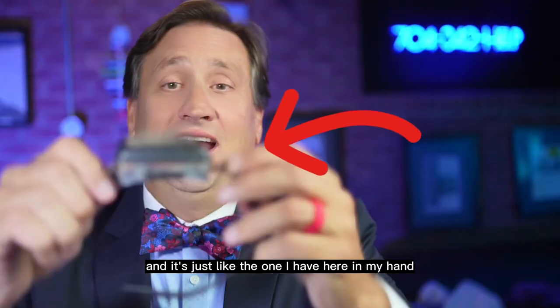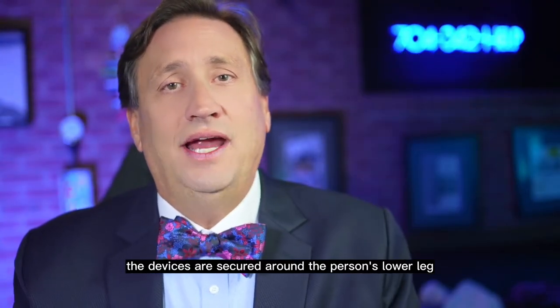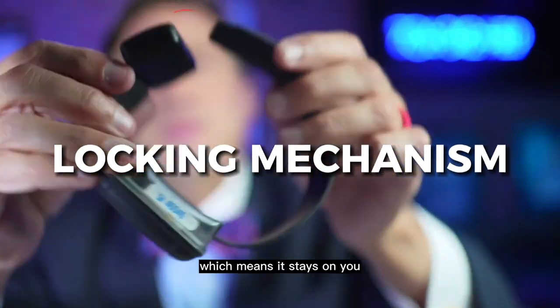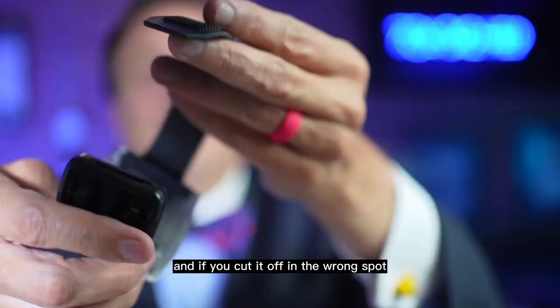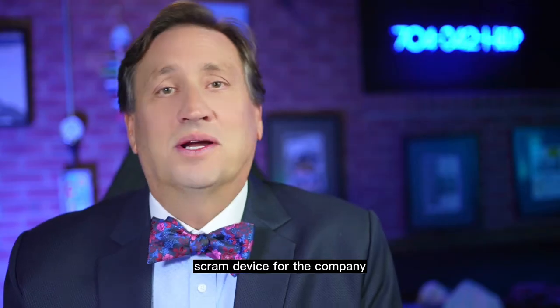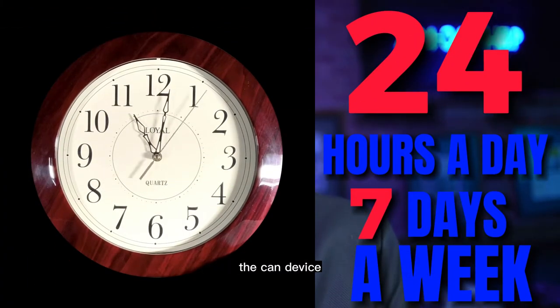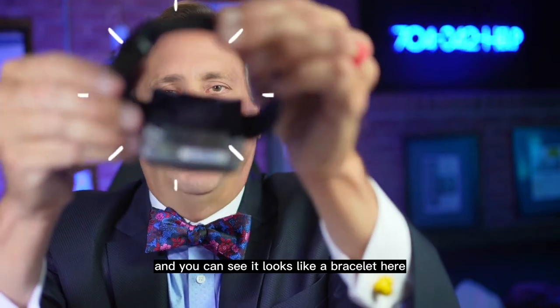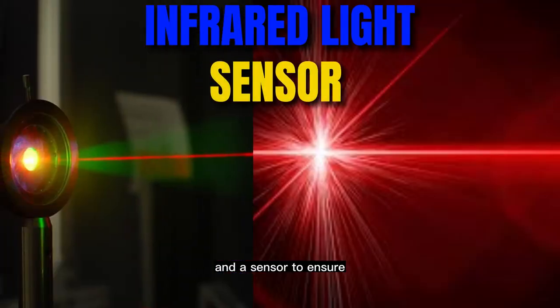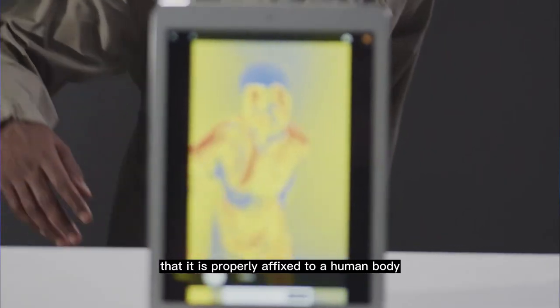It's just like the one I have here in my hand. The devices are secured around the person's lower leg near the ankle using a locking mechanism, which means it stays on you. It may be removed, but if you cut it off in the wrong spot, you basically have bought a brand new SCRAM device for the company. The CAM device, which you can see looks like a bracelet, uses a combination of infrared light and a sensor to ensure, based on skin density and temperature, that it is properly affixed to a human body.